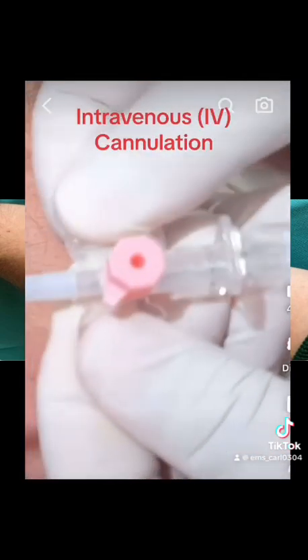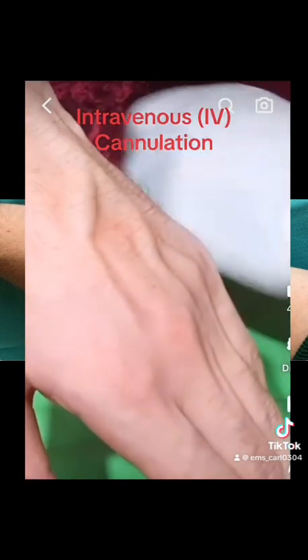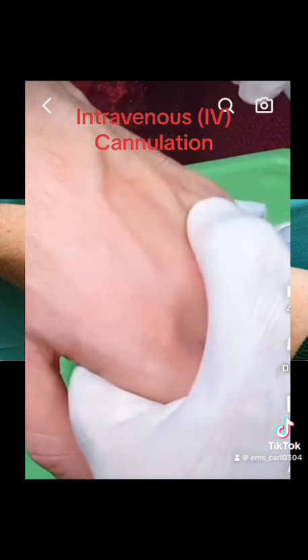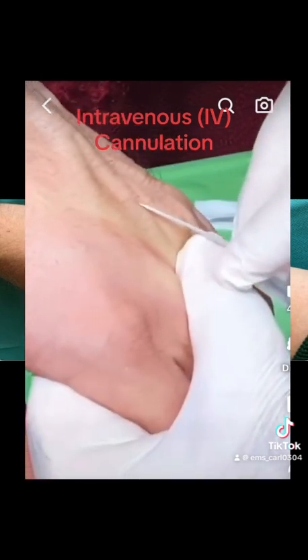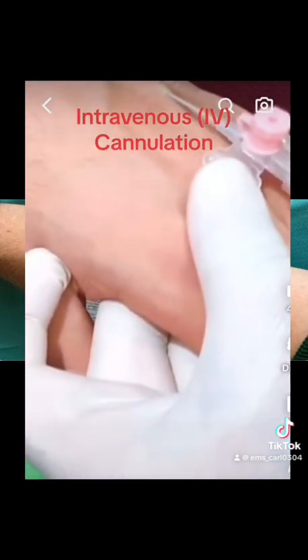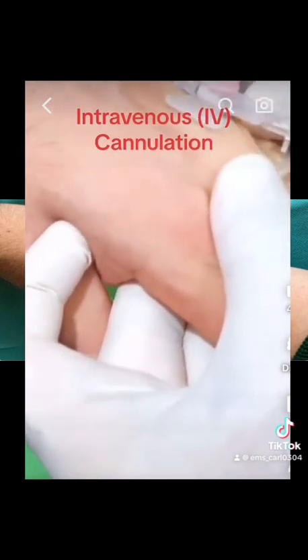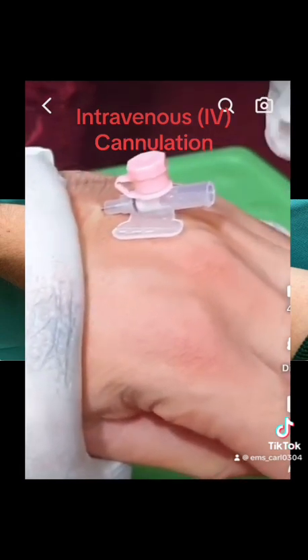Step 7. Insert the cannula at around 10–30 degrees directly above the vein with the bevel facing upwards. Once you get flashback in the flashback chamber, lower the cannula and advance a further 2mm to ensure it's within the vein's lumen. Partially withdraw the needle to make sure the needle is within the plastic catheter of the cannula — blood should be observed entering the plastic tubing at this point. Carefully advance the cannula into the vein while withdrawing the needle until the cannula is fully inserted and the needle is removed.